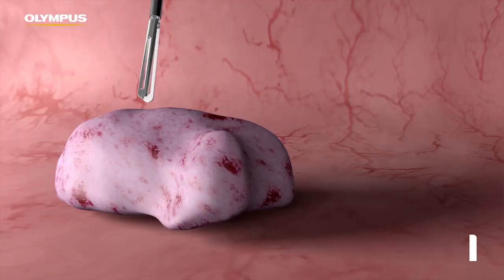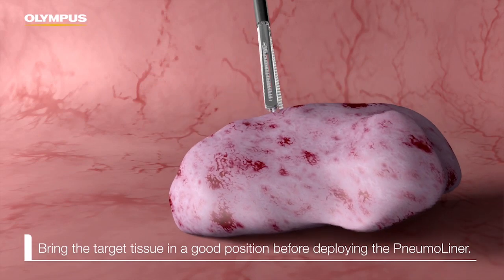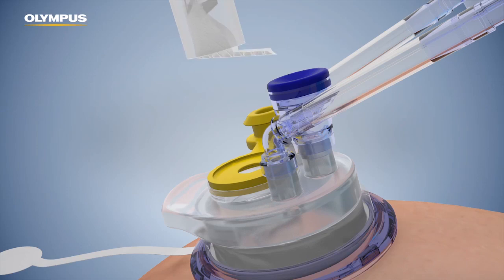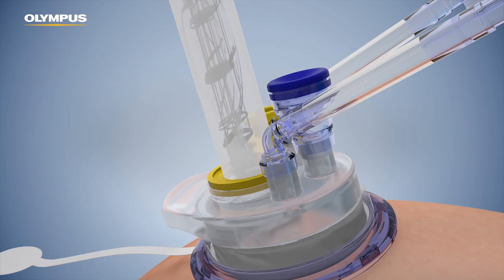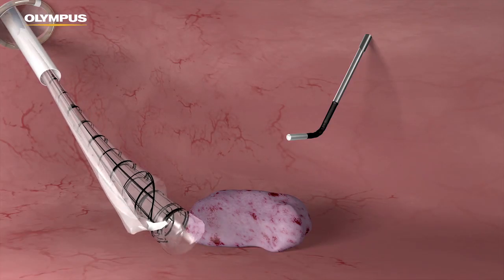Place the target tissue in a good position before deploying the pneumo liner. Insert the pneumo liner introducer shaft, ensuring that the distal tab is the leading end and that it points upwards. Insert the pneumo liner plunger into the shaft and push it forward to deploy the pneumo liner.